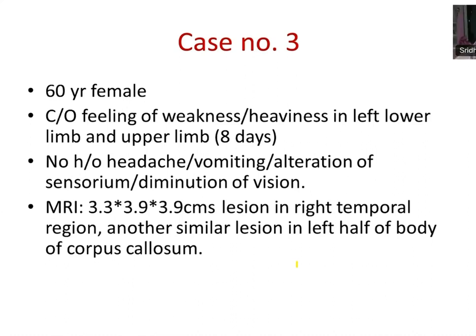It's a 60-year-old female with weakness and heaviness in the left lower limb and upper limb for the past 8 days. No history of headache, vomiting, alteration of sensorium or diminution of vision. MRI, you got some lesion. An older lady, short presentation.